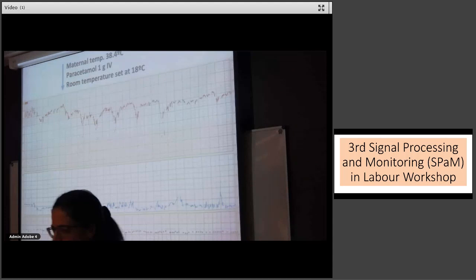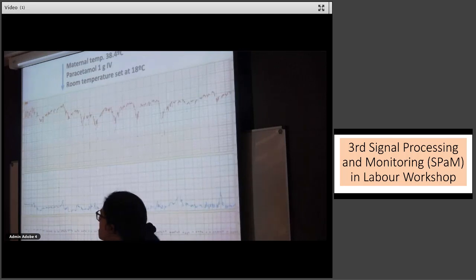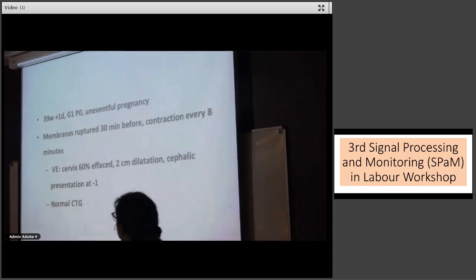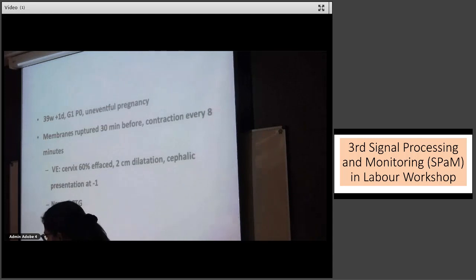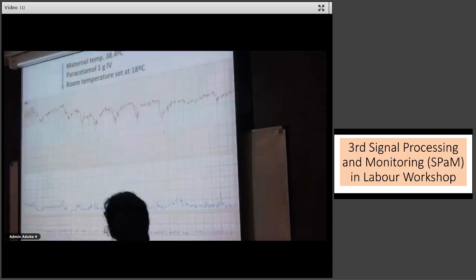Yes. Right, okay. As I understand it, the baby is at term. Baby has a turn. Yeah, so I wouldn't be expecting complications so far as we know. Correct. And the mother didn't have a lot of risk factors for chorioamnionitis because ruptured membranes was, like, 8 hours, well, maybe 4 hours. I can't remember. Plus, you don't need rupture of membranes. Okay, I agree. Yes. You don't need rupture of membranes for chorioamnionitis.